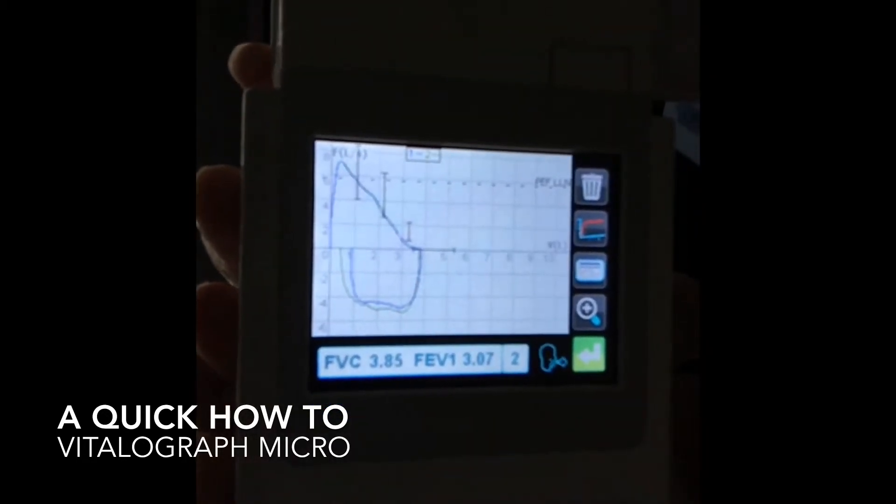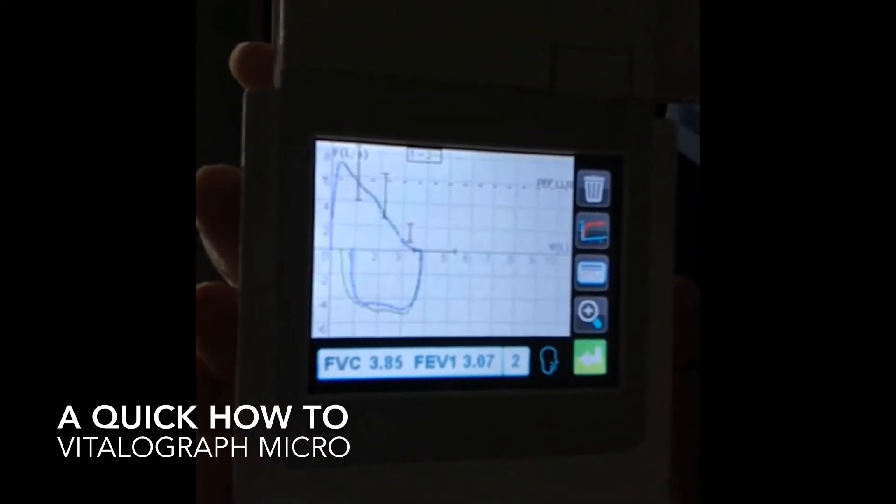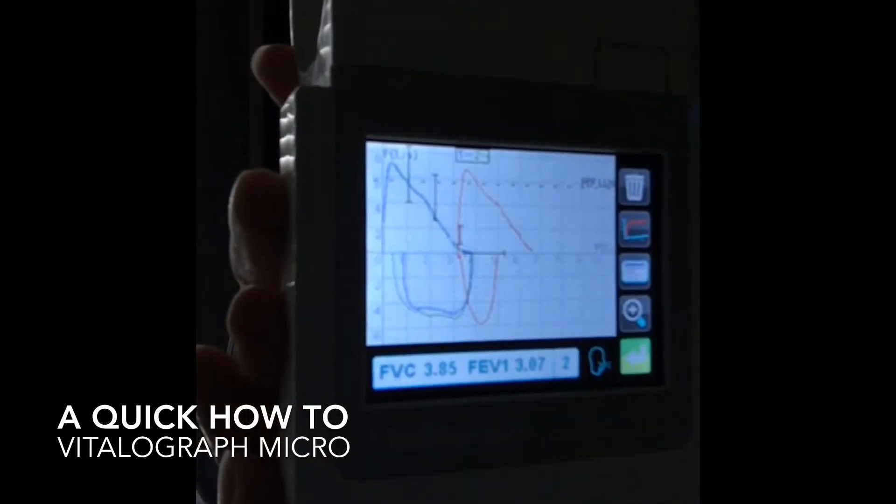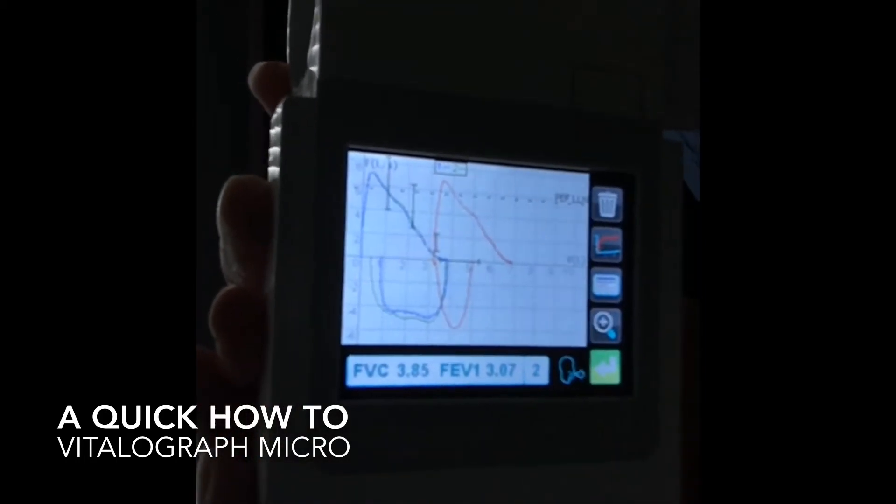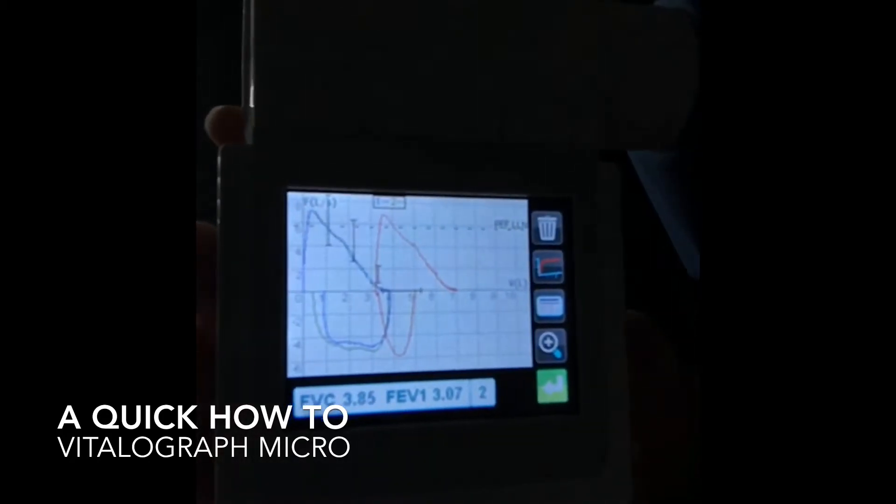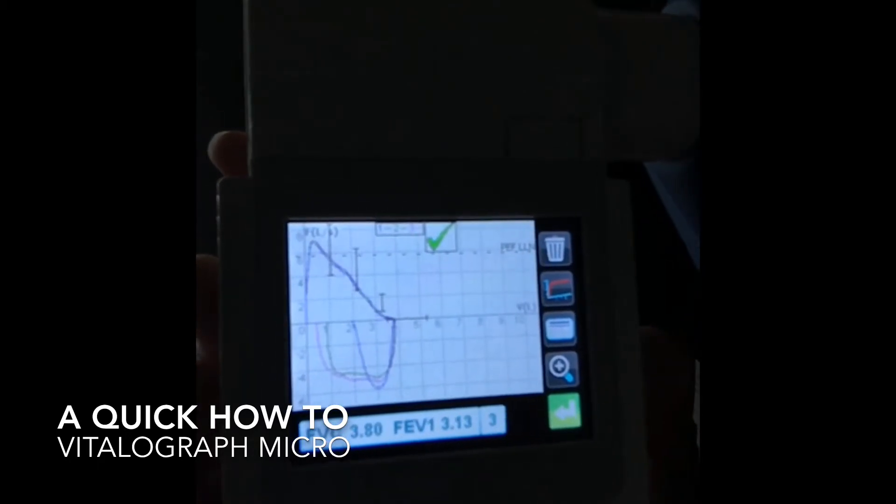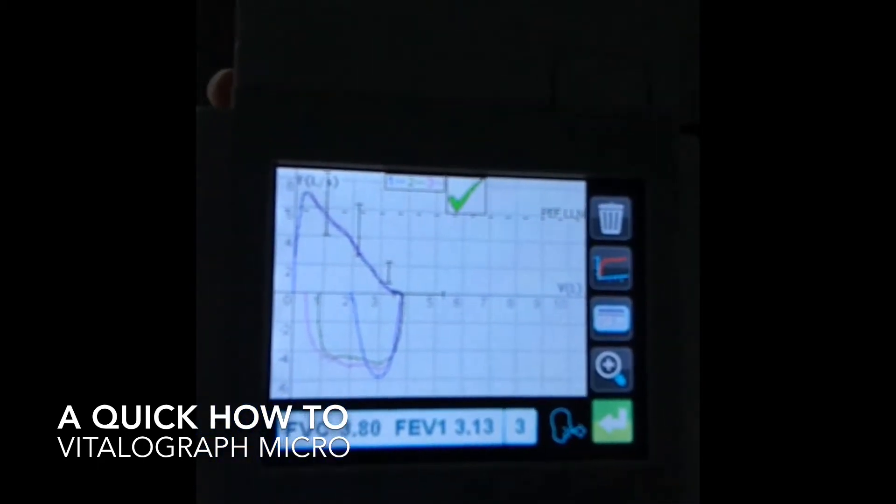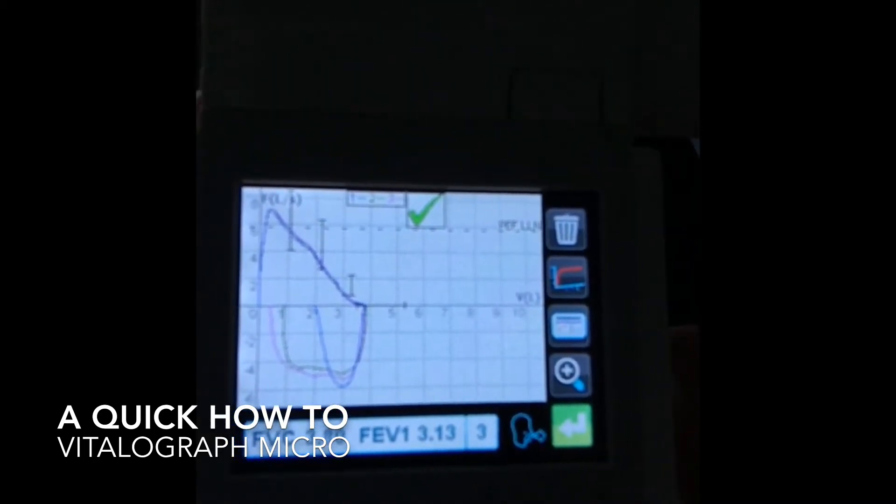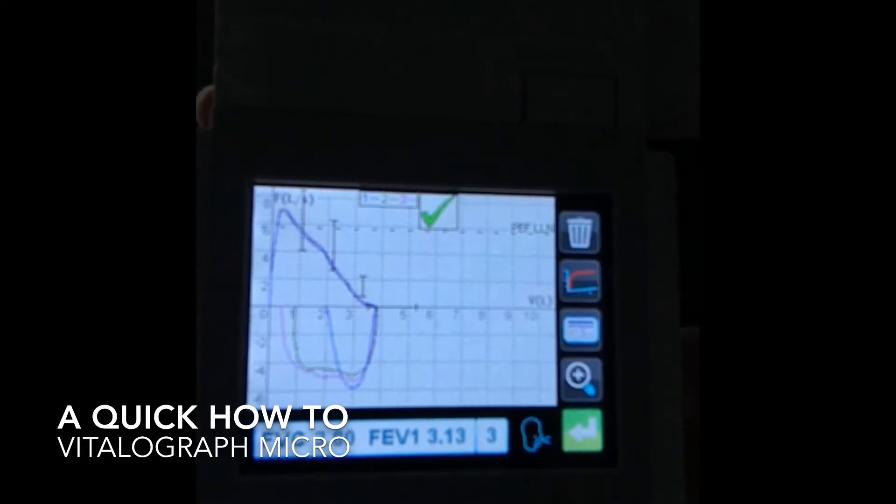And then you need to have three measurements. I'm going to go ahead and blow one more for you. All right. So when you hear that sound on the micro, that indicates that you have a minimum of three acceptable maneuvers on your device for that particular testing session.